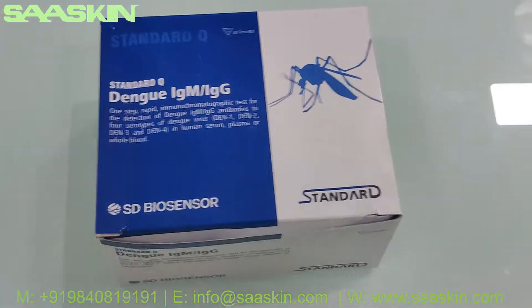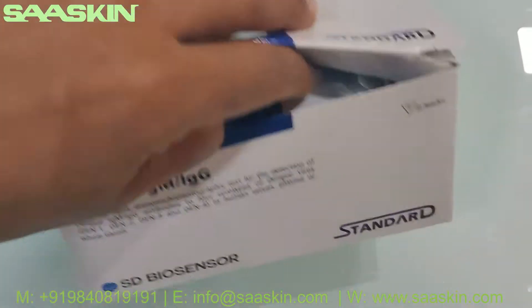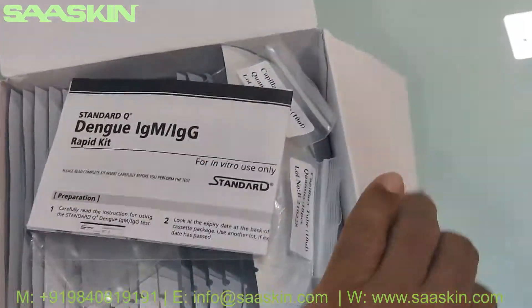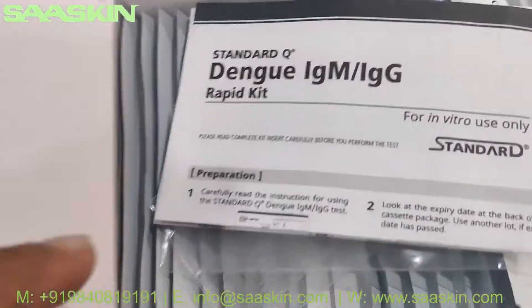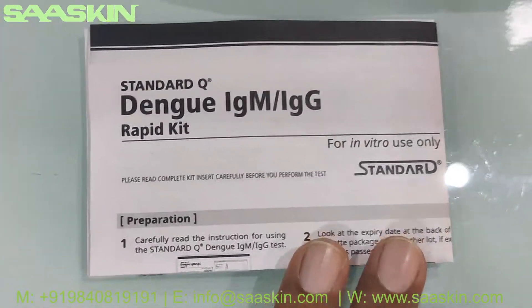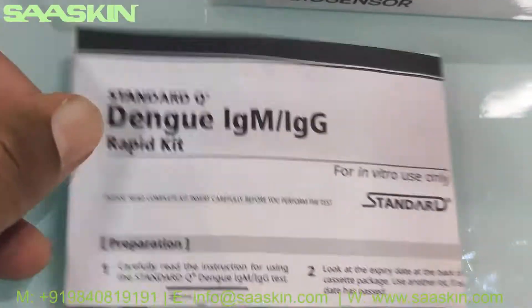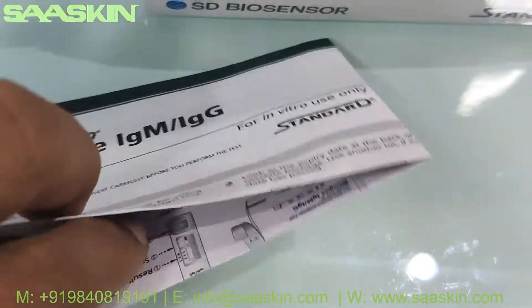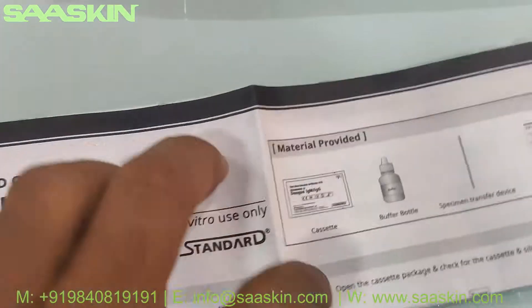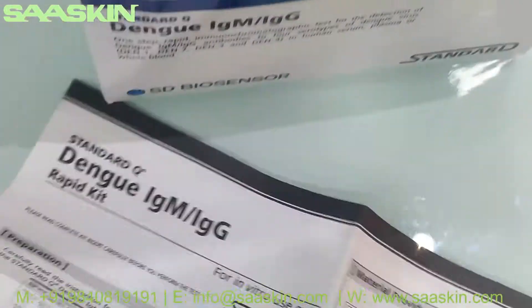Now let me open this box. Inside you get an instruction manual — instruction for use. The instruction sheet covers sample preparation, the test procedure, and the interpretation of the test results.